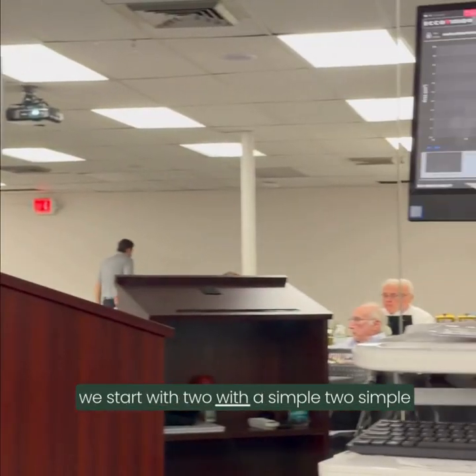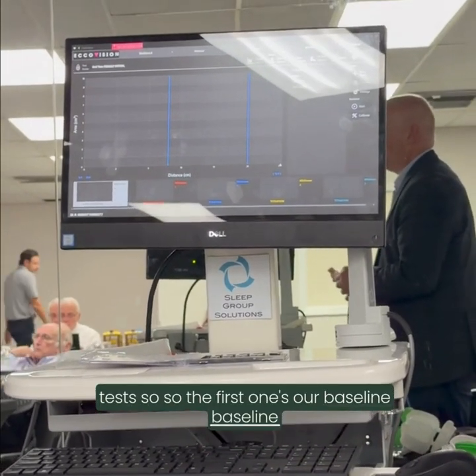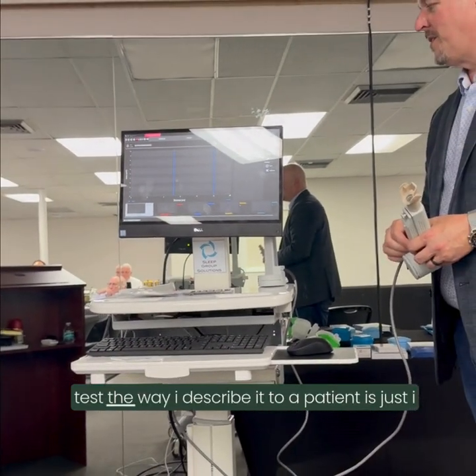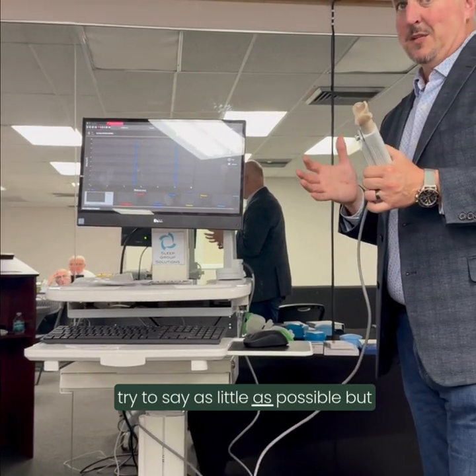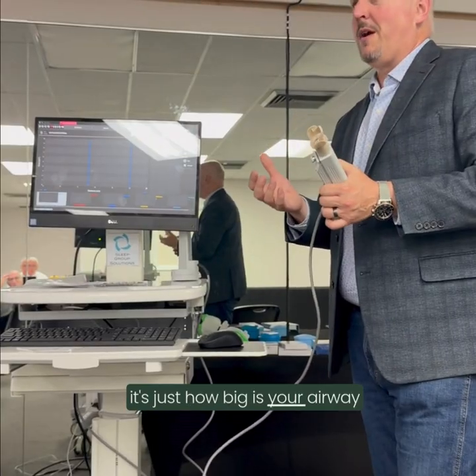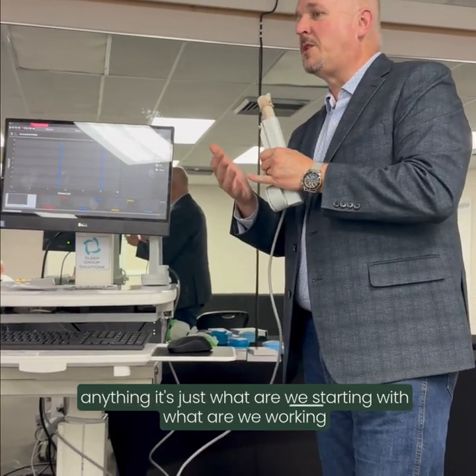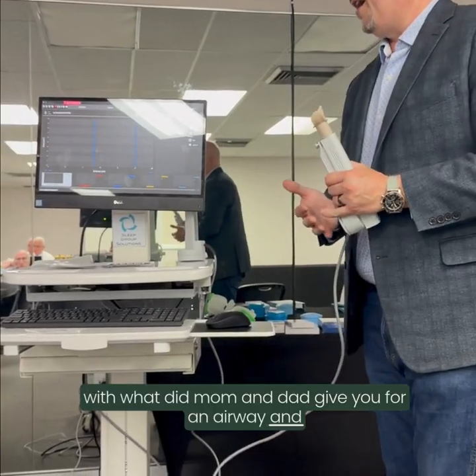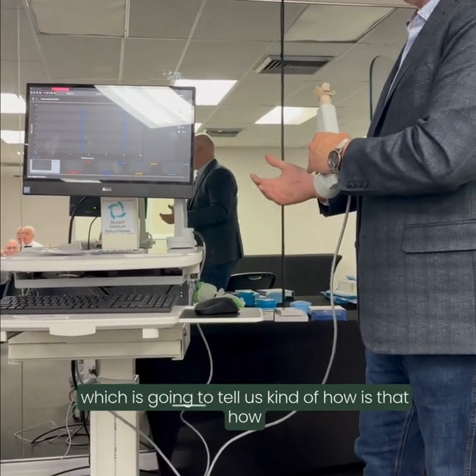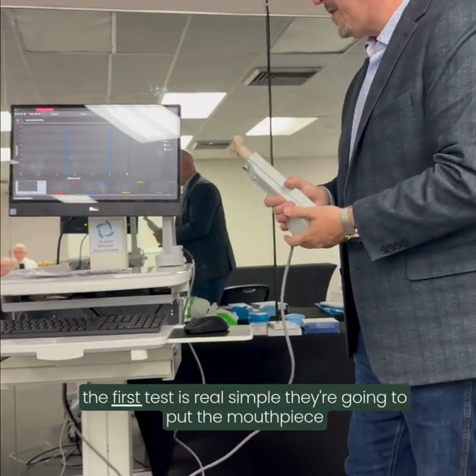Pharyngometry, we start with two simple tests. The first one's our baseline. The way I describe it to a patient, I try to say as little as possible, but it's just how big is your airway? It's not whether it's good or bad or stable or unstable. It's just what we're starting with. What did mom and dad give you for an airway? Then we'll move on to the next one, which tells us how that airway behaves.